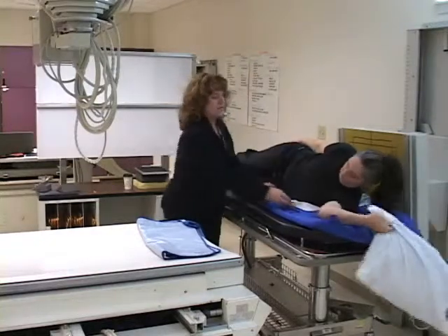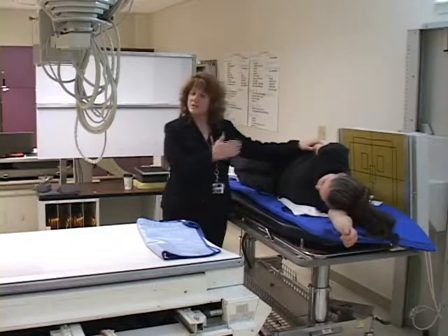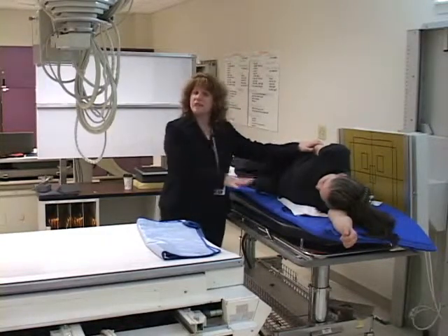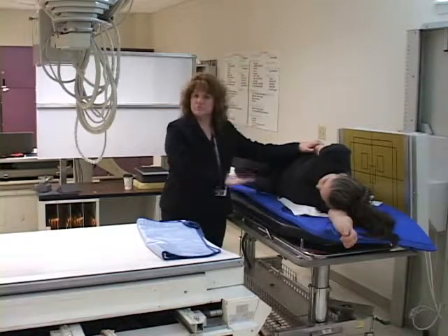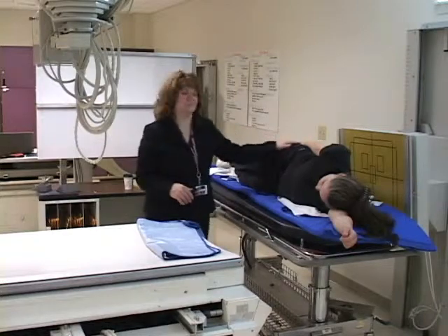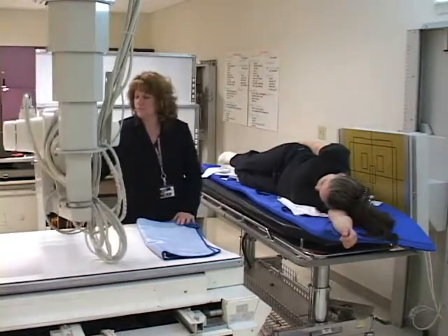Okay. Then I'm going to start getting all of my equipment ready to go, because I generally want them to be on their side for about 5 minutes. That allows all the fluid to fall down and the air to rise up, which is what we are looking for. So I will come over here. I will bring my tube down.